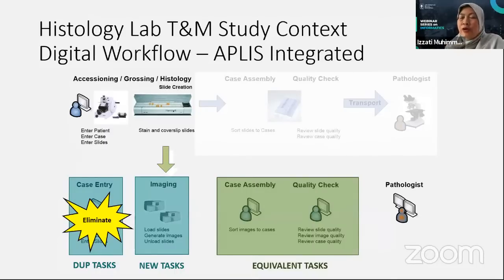In our case, we have close collaboration with the Sleman area, where the university resides, and also the Central Java Temanggung area. From that we set up focus group discussions about the user requirements of such a system, particularly for tuberculosis case reading.